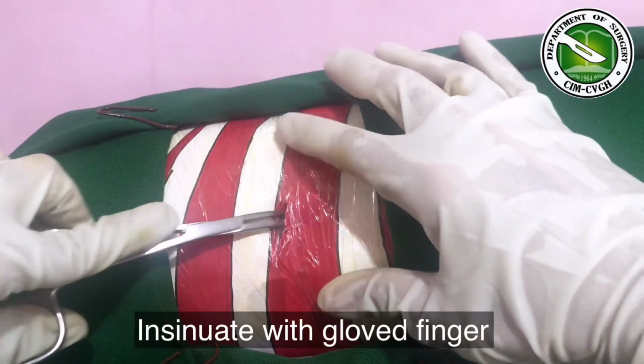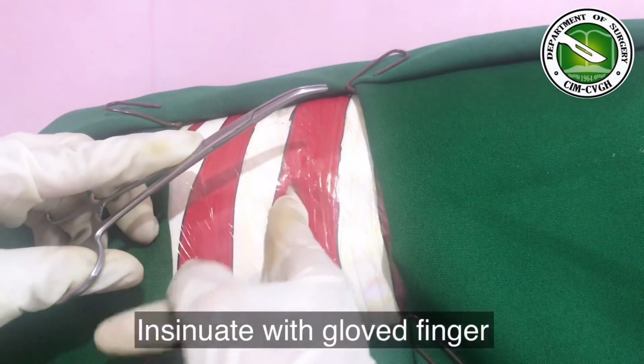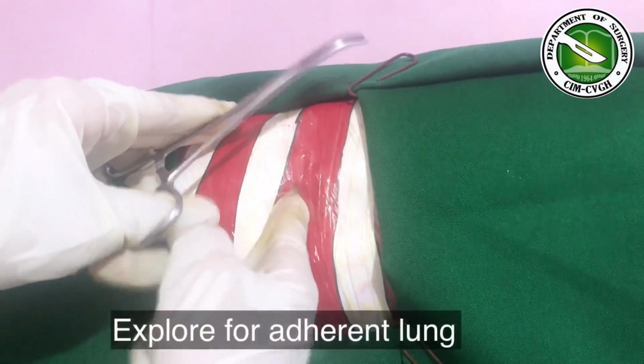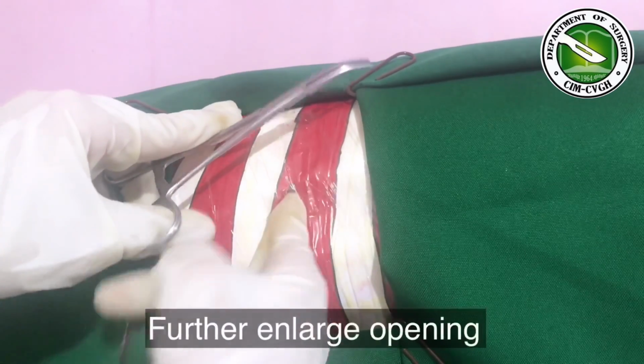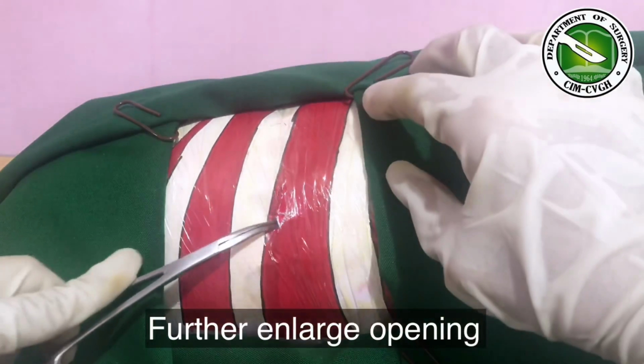Remove the clamp and explore the track with a gloved finger from time to time to make sure the track is going in the right direction. After the pleural cavity has been entered, insert the gloved finger to explore for adherent lung and then further enlarge the opening in the pleura by inserting a large Kelly clamp and by spreading it.